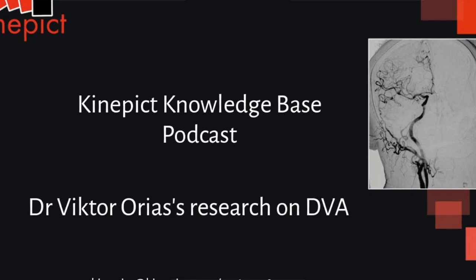To address the quality and clinical usefulness of the low-dose protocol DVA, 19 pairs of the 100% contrast media DSA images and 50% contrast media DVA image runs, taken from the same patients and directions, were compared in a randomized and blinded manner.